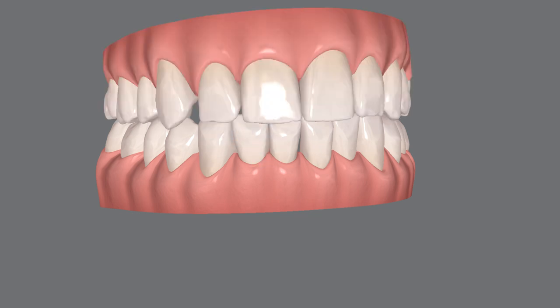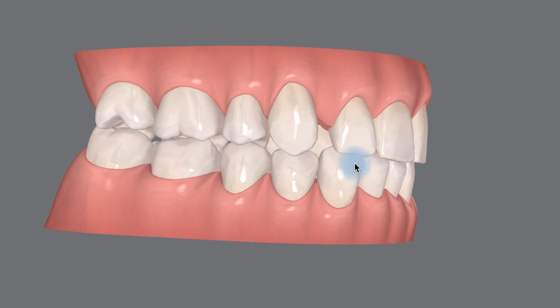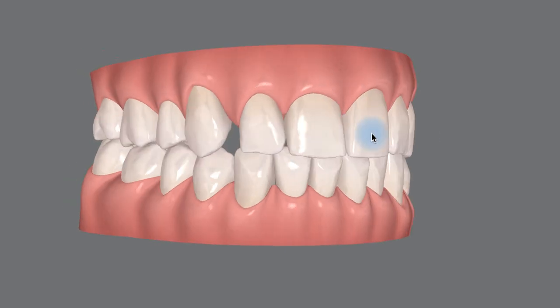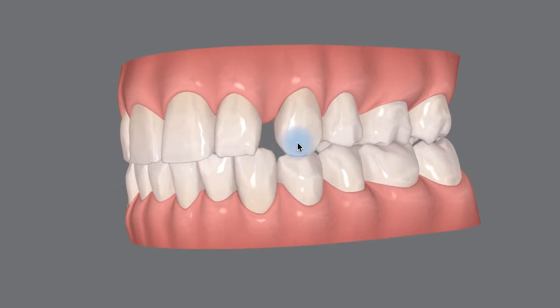So all that really leaves us is the other option, which is to create space on the upper. That's definitely going to be part of the solution. I really don't see there being any other way other than removing your front teeth for us to get your lower teeth to come back together, which I don't think is something you're looking to do. So if we accept creating space as a potential avenue for us to solve your problem, the question is, where do we put the space?